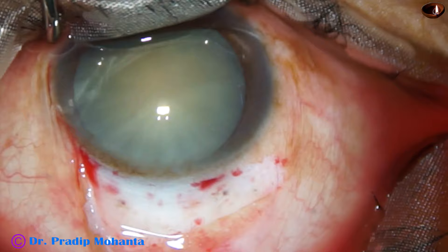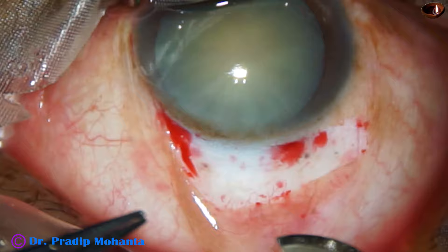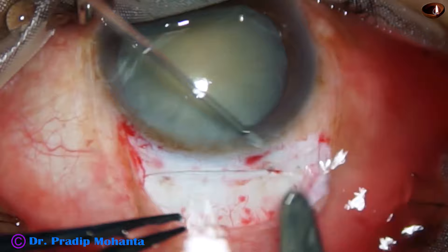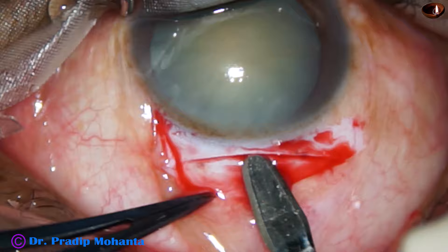Now is the time to place the incision. I take a Bard-Parker blade number 15 and place the initial incision. This is about one-third depth of the sclera — you cannot teach this, it is just a judgment. Beginners can use guarded knives for placing the initial incision. Now, this is a crescent blade. I am making the depth equal all around so that making the tunnel becomes easier.